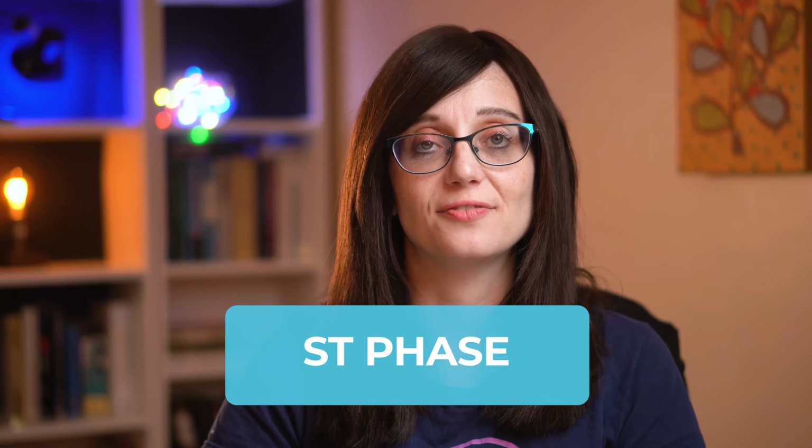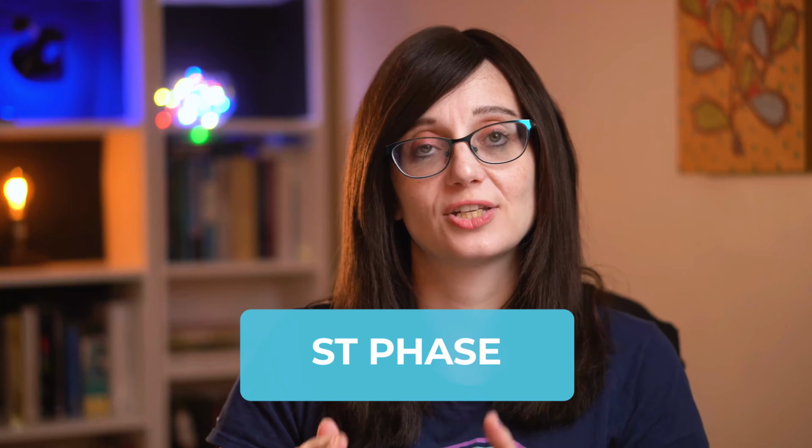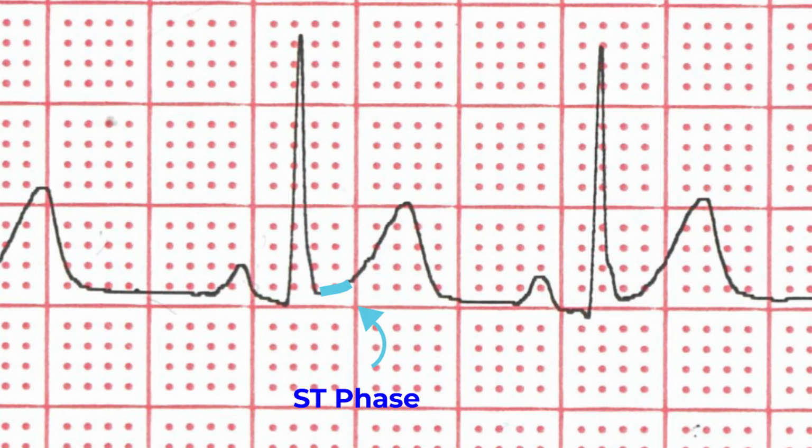Next, we need to look at the ST phase. This is an isoelectric segment, which is what happens just before the heart resets itself. So you shouldn't be seeing ST elevation here, you should be seeing an isoelectric ST segment.